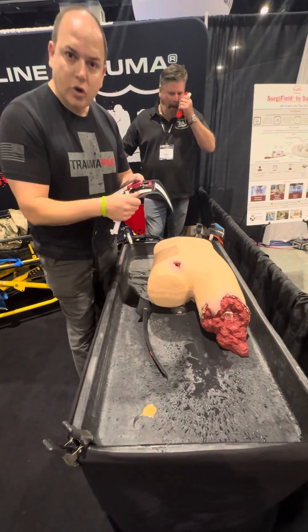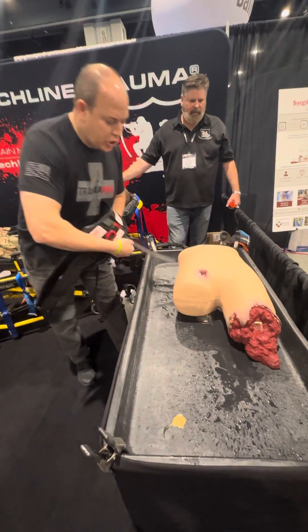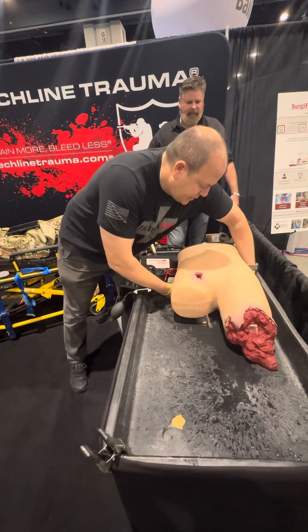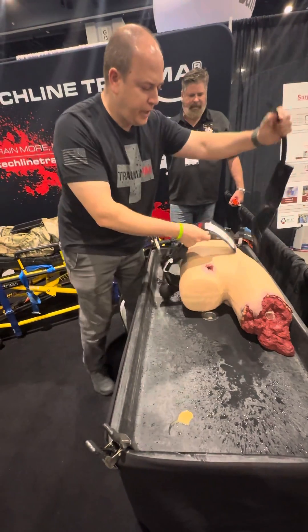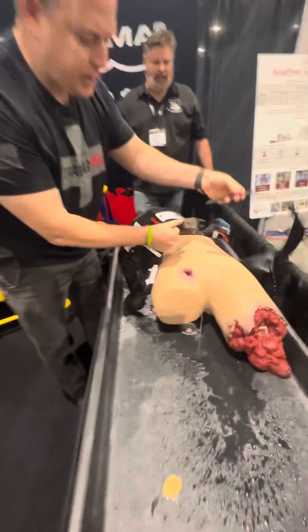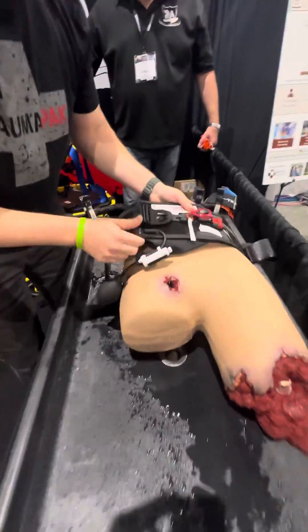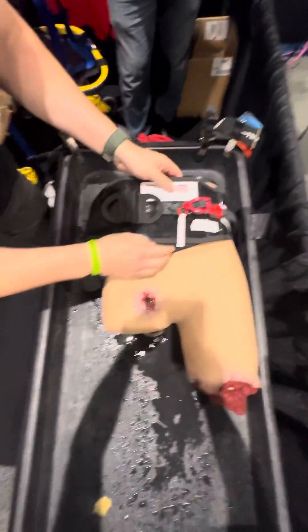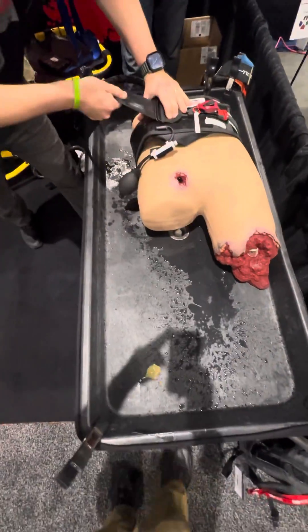I'm going to orient this towards me — I lead with this edge here. Now I'm going underneath. You can see how this is red to red; I'm going to insert it red to red just to this red here. I'm going to orient right over the umbilical area and then pull this towards me — that's why I oriented it towards me.